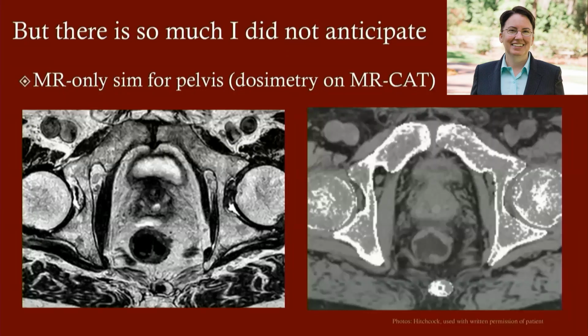On top of that, as you can see, the images that I get are absolutely beautiful. Many times our simulation MR images rival what patients have gotten diagnostically and exceed them in a lot of cases. I had a long struggle convincing my clinic that we should have our own MR imager, but that wait meant that we got some really nice technology. We've got the very latest and greatest, and it has made a huge difference in my ability to see tumors.